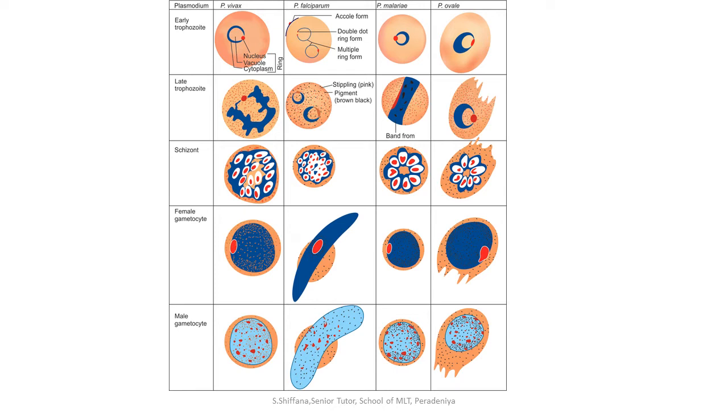Inside the cytoplasm we can see brownish, yellowish brown malarial pigment. When we consider the red cell cytoplasm, we can see Schüffner's dots. And the morphology of the RBC in Plasmodium vivax is larger, an enlarged RBC compared with a normal RBC, and the color is pale compared with the normal one.